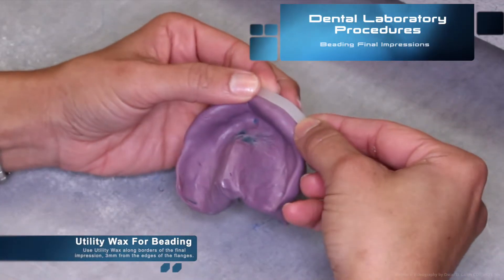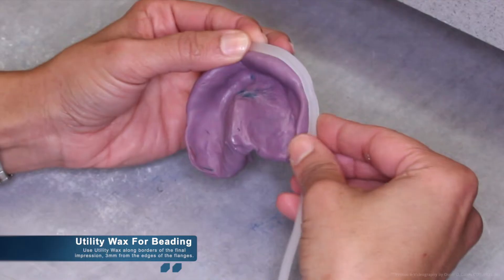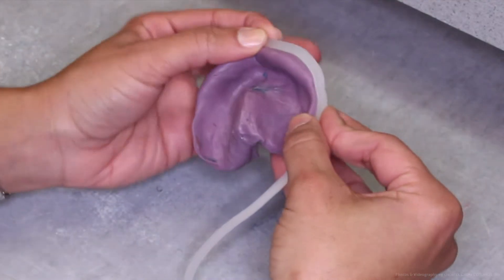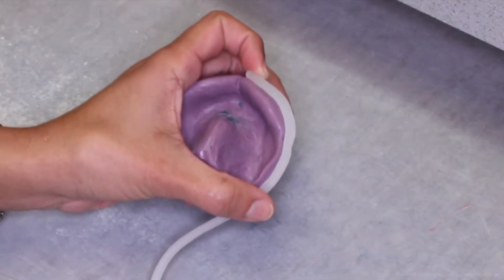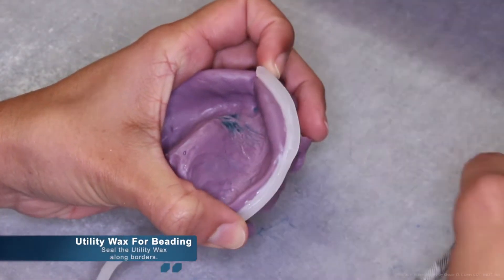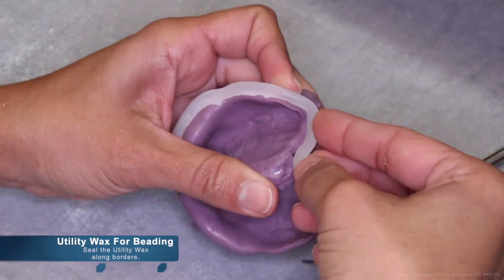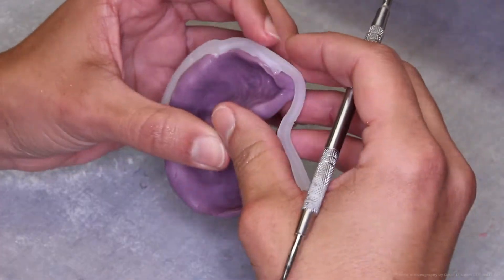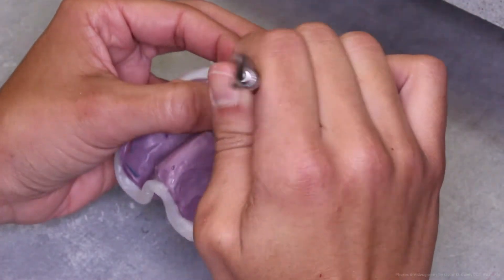We begin with beading the final impressions. You may use utility wax along the borders of the final impression. It should be placed about 3mm from the edge of the flanges of the final impression. Beading a final impression can look a lot easier than it actually is. To facilitate the process, it's a good idea to seal the utility wax around the borders with a hot spatula. Sealing the utility wax as you rope it around the impression aids in keeping it in place as you position it.